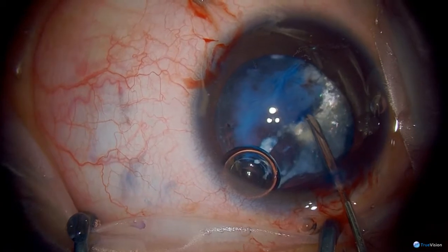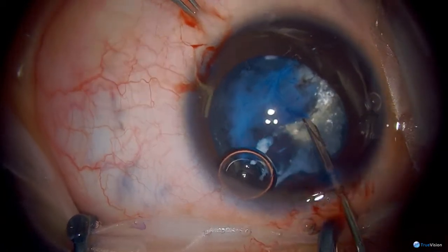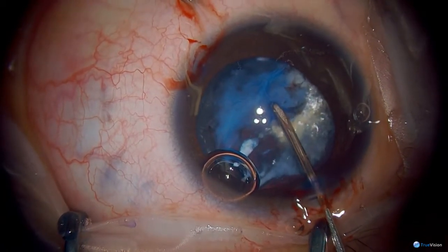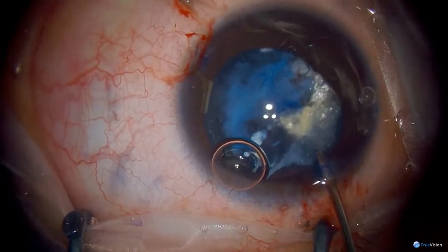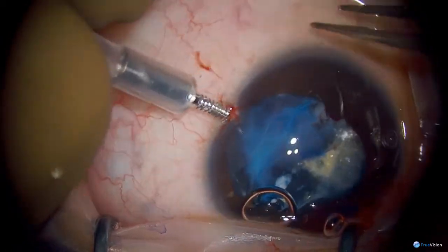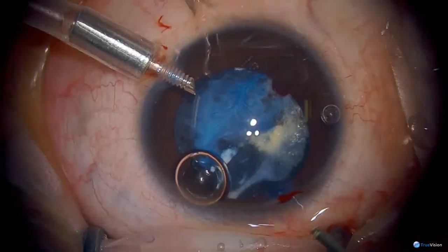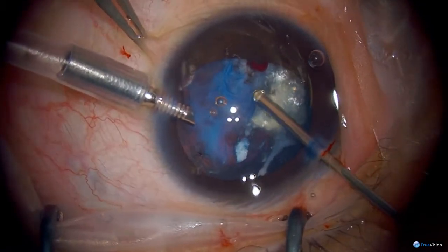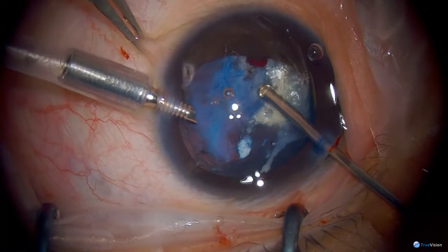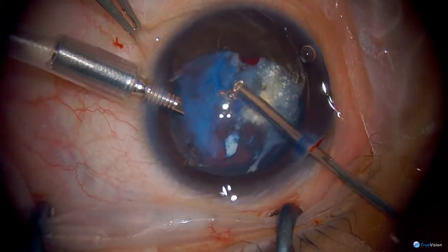What I'll do is I'm actually going to use the cutter to do the rhexis, because there's a fibrotic plaque, so I don't think the Utrata will do very well there. So we're just going to move on to do it with the vitrector first. So I'm just going in now to enlarge the capsular rhexis.